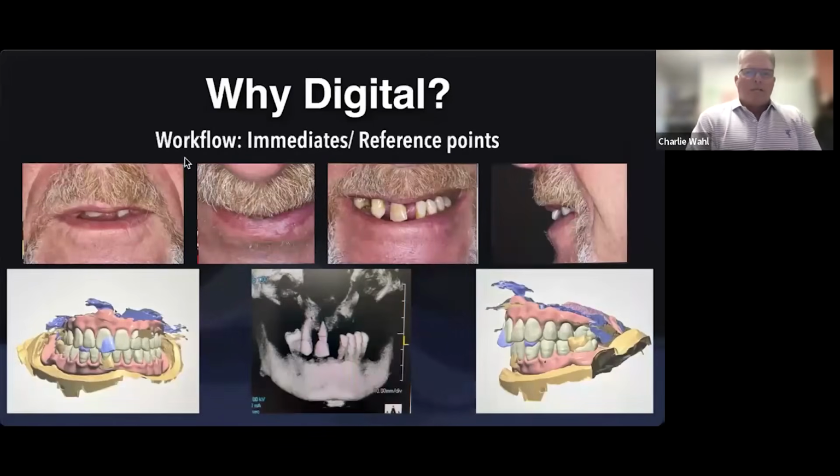So this is how we treat a lot of our patients. They come in with failing dentitions, and through the years of All-on-X and having Clear Choice, pushing us to do teeth in a day and all those things, we always look at, hey, how can I get these teeth out? How can I get implants in? How can I get these patients in provisionals as quickly as possible? And if you've done it long enough, you also come across failures.